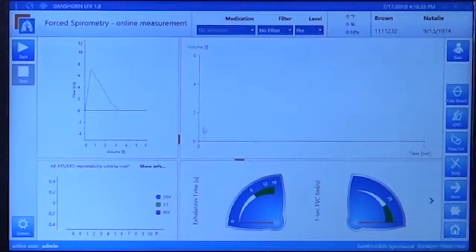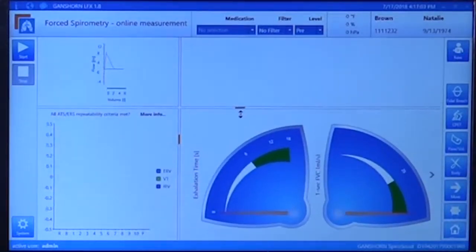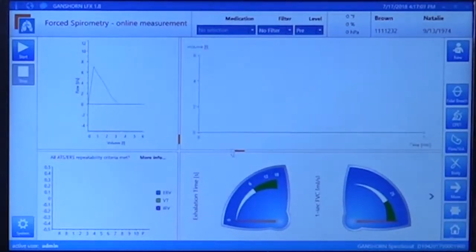You can change the sizes of these screens if you want to put the incentives bigger so that the patient can see them, or smaller. It all depends on what you want or what the patient wants. For an adult patient, these two speedometer-like screens will help the patient to achieve the 6 seconds asked for on spirometry by exhalation, and also the 1 second FVC in milliliters per second, the force of exhalation.